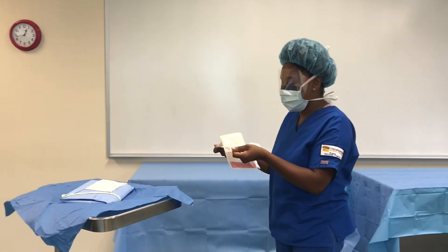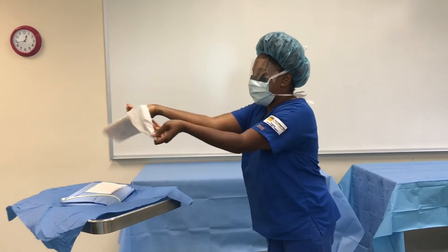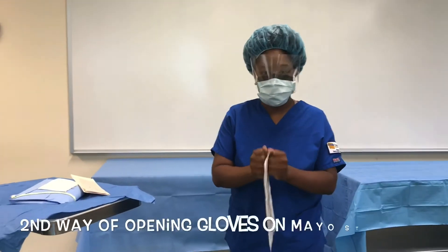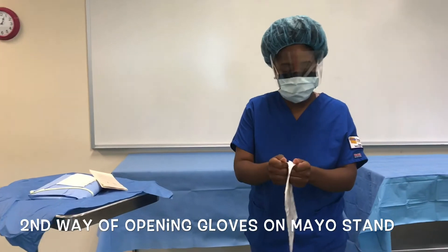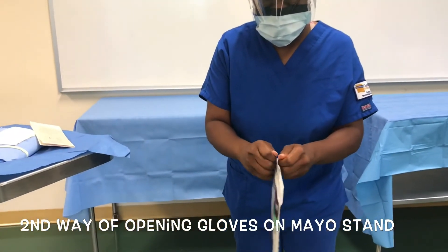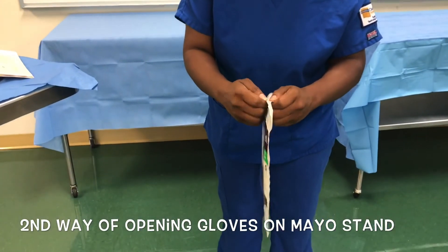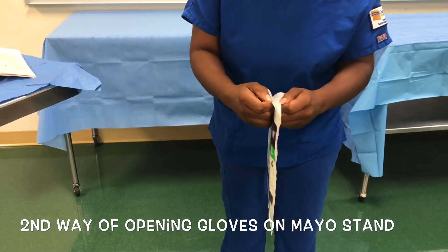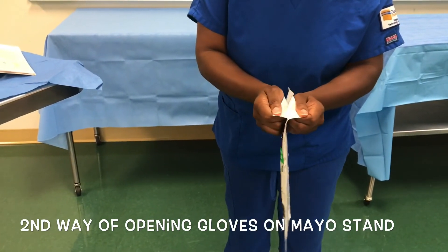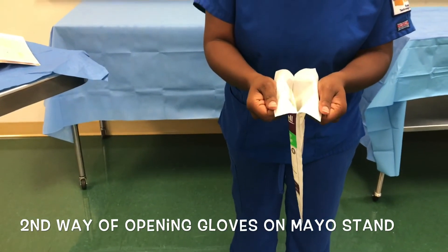Make sure you are not touching the Mayo stand or anything. For the second glove, I'm going to show you again how to open it up without touching the insides. Take the corners and work your way through it without touching the inner part of the package — get in the corner, there we go. You can hold it just like this.